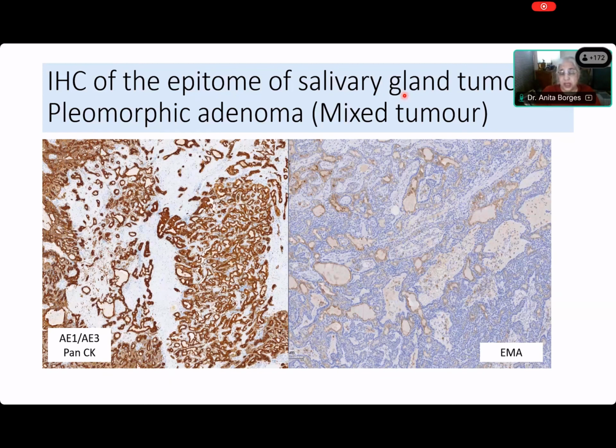Are they cribriform? Ma'am, give me the pattern. What is this forming? Gland formation. Oh, okay. Shivani, what is it forming? The green things, there is acini with secretion. Acinus with secretion. Okay. Akshara.